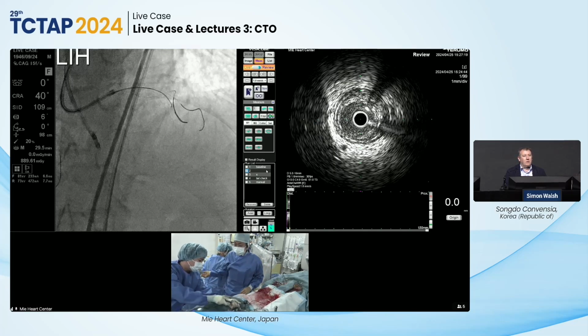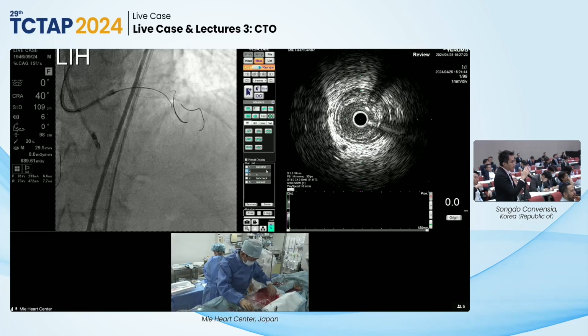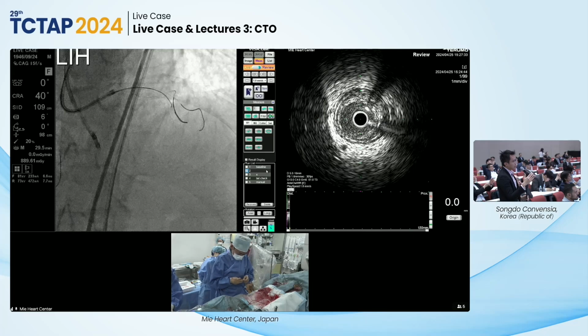Because some say that Crusade Type R has a bigger angle compared to Sasuke, which has a narrower angle for the second port, the exit port. So I wonder, would it be helpful? When we went through training, they said that Crusade Type R, because of a wider angle, is more suitable for bifurcation wiring. Do you think it makes any significant difference in this case, or not at all?